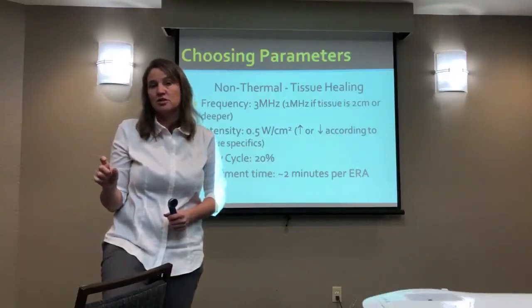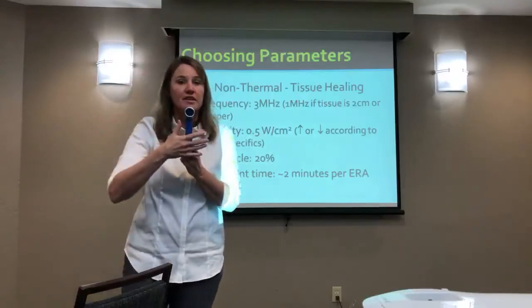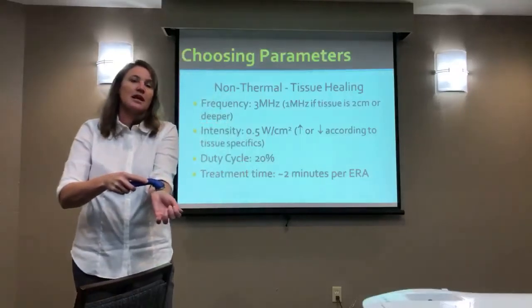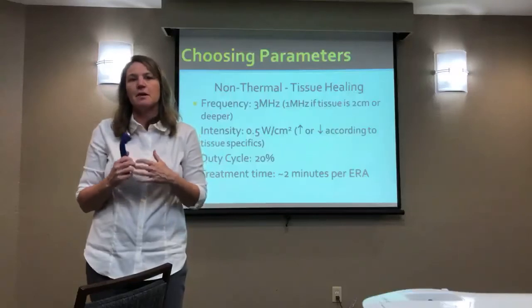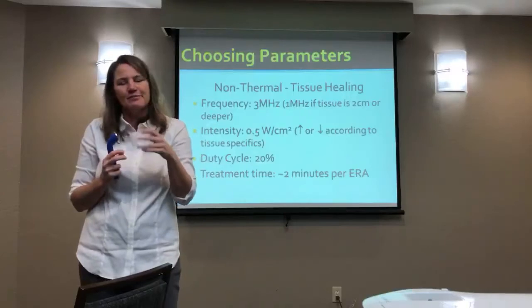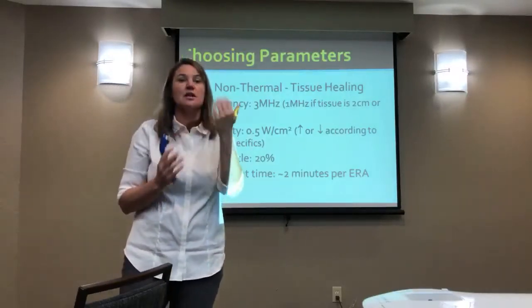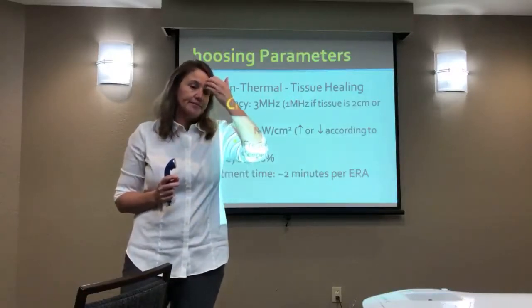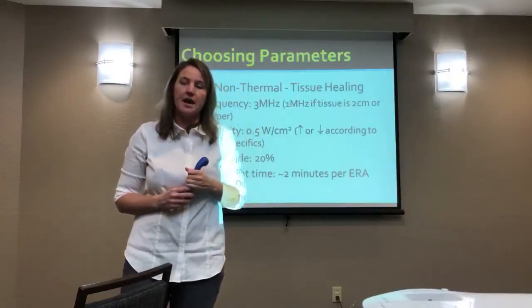It just makes more sense that if you think about how the ultrasound energy comes out and the uniformity of it, I would feel like going in a linear way would be more likely going to get as much energy deposited as possible, versus if it's maybe a muscle spasm, you've got the center of a muscle, which I don't know if I would do a non-thermal there anyway, but you know what I mean? If the shape of the area, let's say a wound, if it's a wound target, a circle may make more sense. What about like a knee, a shoulder or something that's more rounded?